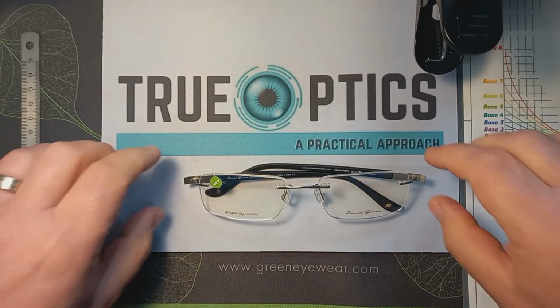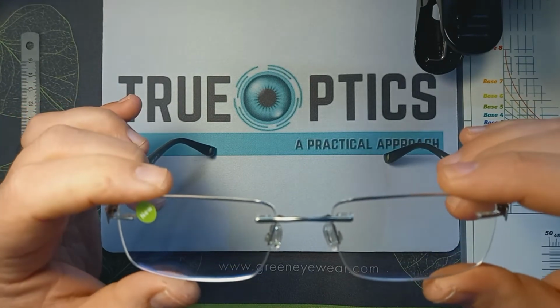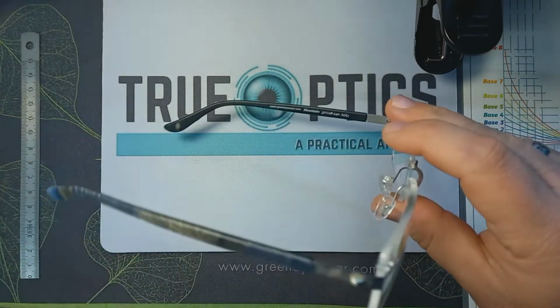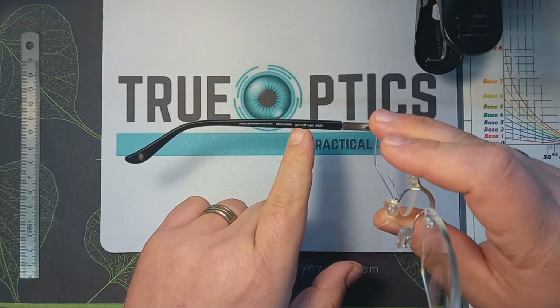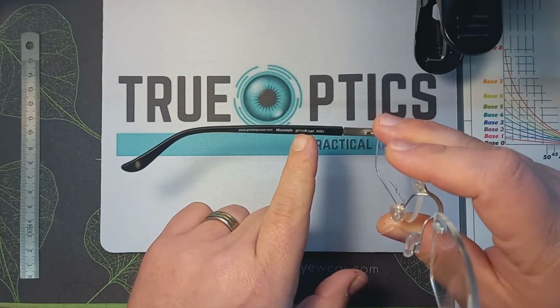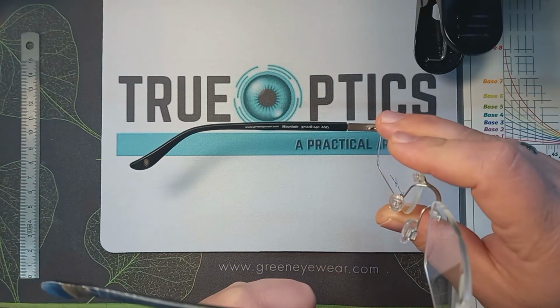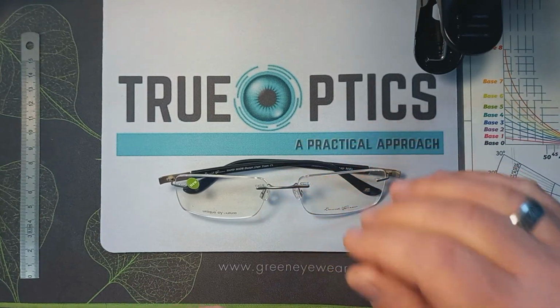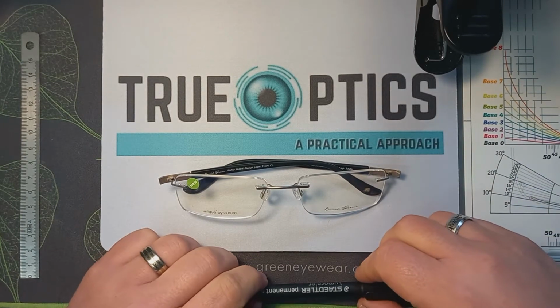Cool, let's do this. I'm still using my David Green rimless frame just to make the measuring process a little bit easier, so I don't have to compensate for a frame. Now, you should know that 57 is our A box measurement and 18 is our DBL measurement. If you add those two together, you get your frame PD, which in this case is 75 mil. In the previous video, we said that our patient PD is 65 mil, and we're going to continue with our patient PD as 65 mil.